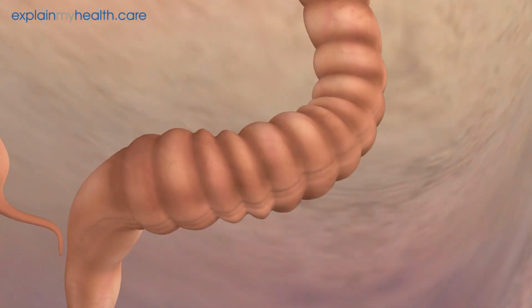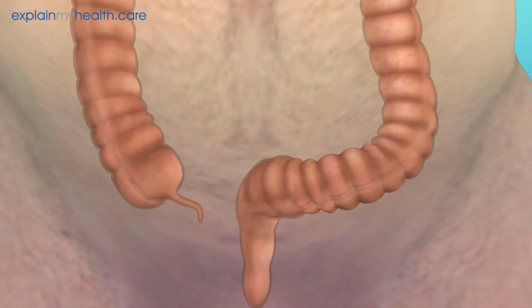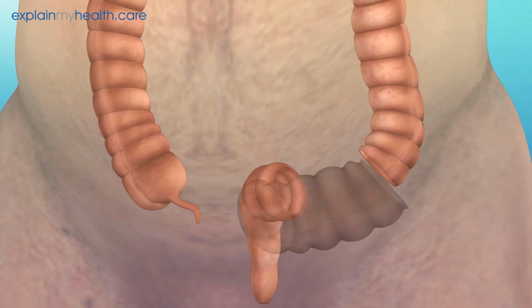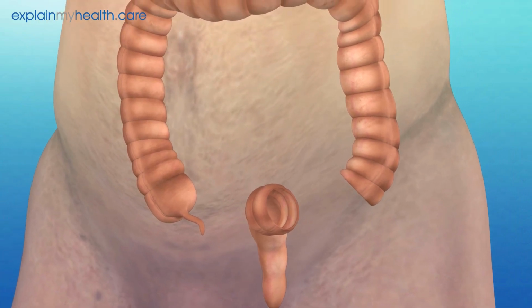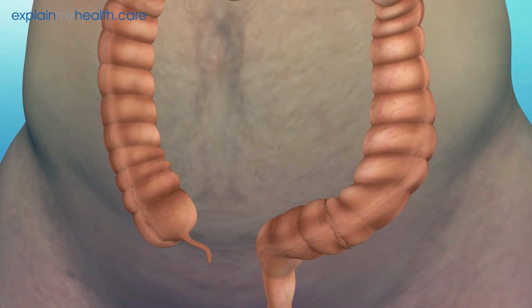The surgeon will navigate towards the diseased area of bowel. They will examine it before making a cut in 2 places and removing the section in between. Where this is and the length of bowel removed will depend on your individual circumstances. If possible, the 2 healthy ends will be joined together using sutures or staples.